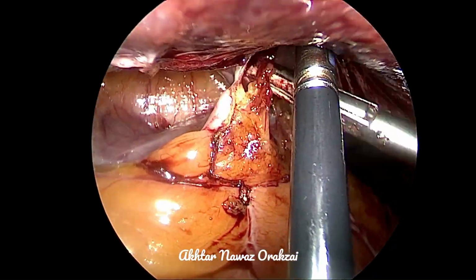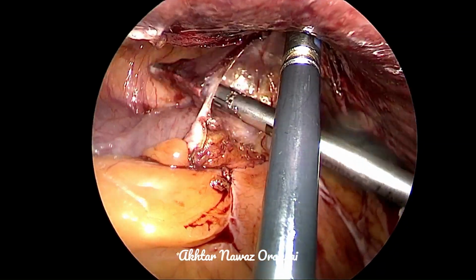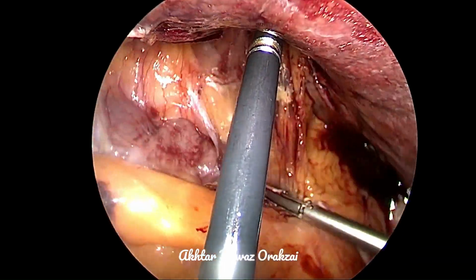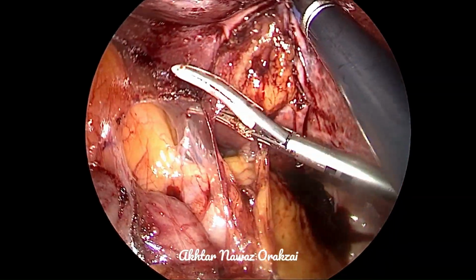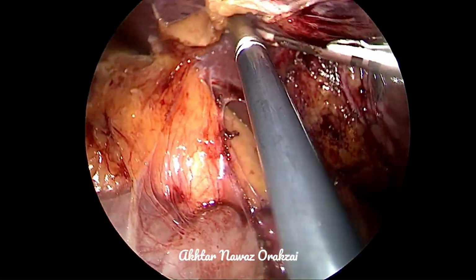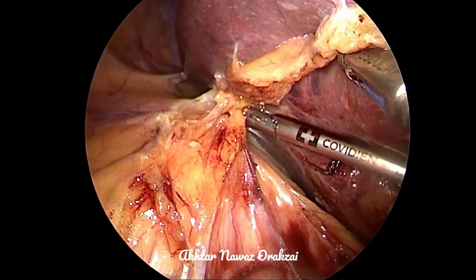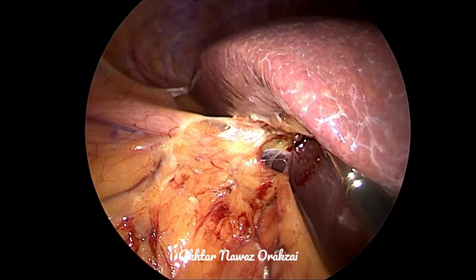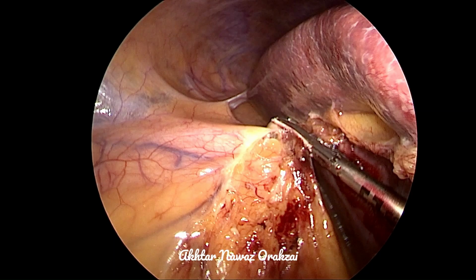Care must be taken not to injure the part of the colon which we cannot see, as we all know that the laparoscopic view is a two-dimensional view, so one can miss some delicacies, and this can lead to various complications. Here nicely it has been mobilized, and the wall of the colon is beautifully intact. So moving forward towards mobilization of this part of the liver for retraction, we go a little more further, and slowly and gradually things become easier.